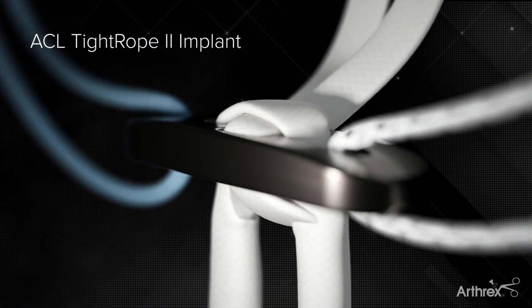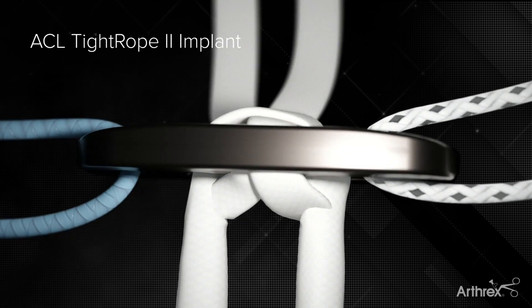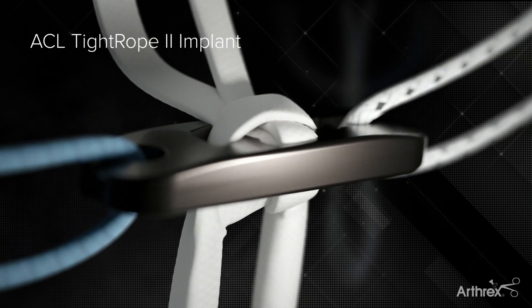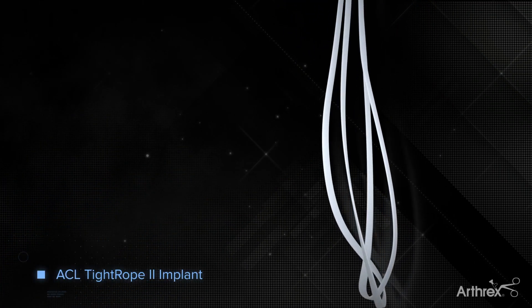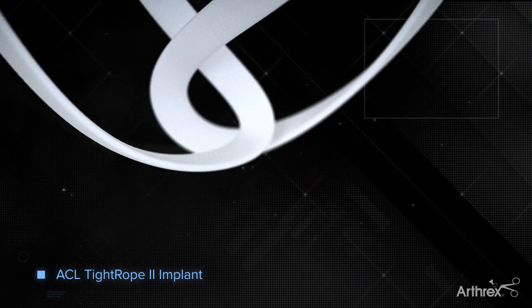Newly redesigned, the ACL Tightrope II implant represents the next evolution in suspensory graft fixation. For additional strength, the Tightrope II loop is constructed of a flat tape, creating a broader suture-graft interface.